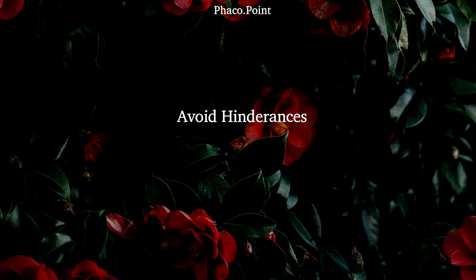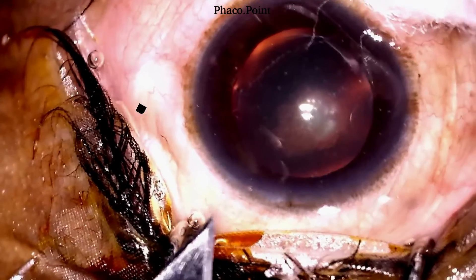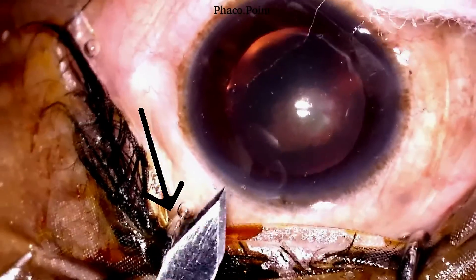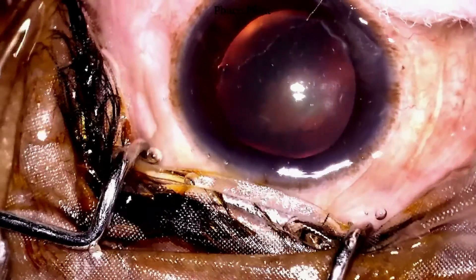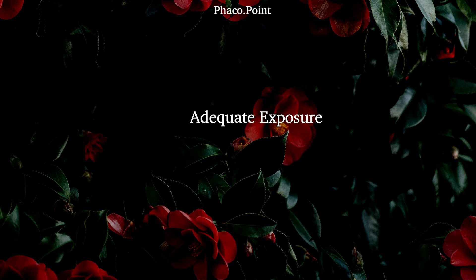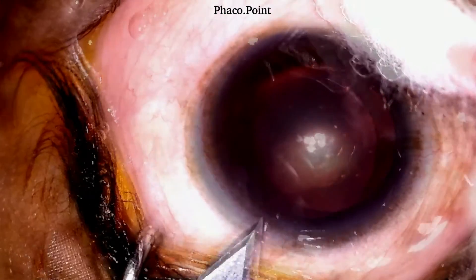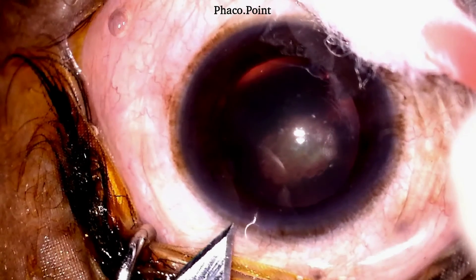It's important at all points that we ensure there are no hindrances. In this particular case, you can see that the speculum is coming in the way of making the main incision, so it's important to move the speculum out of the way to have no hindrances while creating the clear corneal tunnel. You must always ensure that you have adequate exposure. Here you can see how the surgeon turns the eye downwards to bring the limbus more centrally, enabling us to make a perfect tunnel.